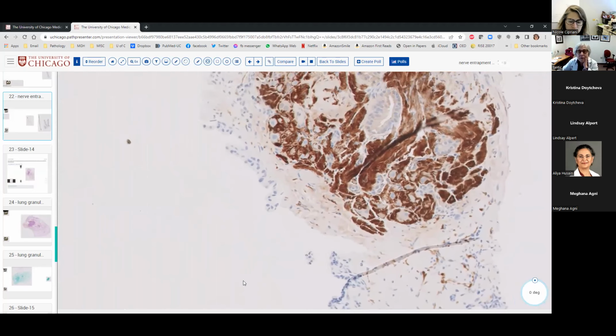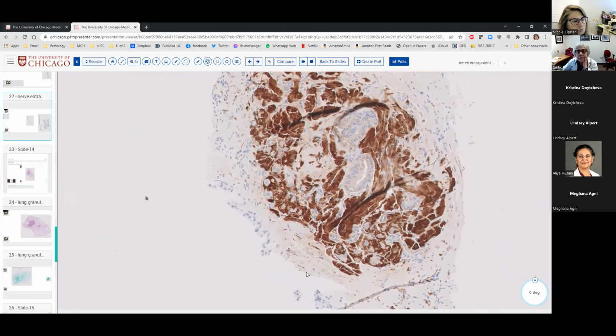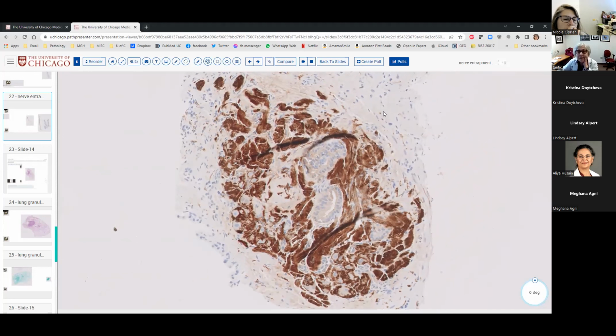And this is beautifully positive, as you can see. Especially stromal cells. And you can see how nicely organized this structure is. And then you see embedded glands within. Therefore, again, cytomorphology rules, number 1, with addition of immunohistochemical stains to confirm.